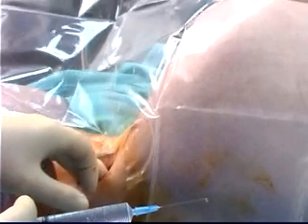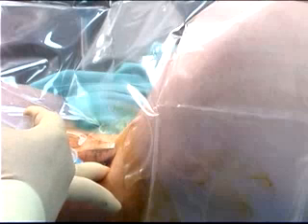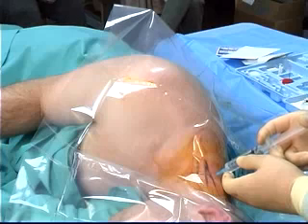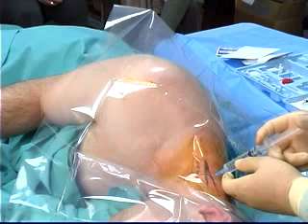After skin preparation, the area is covered with a sterile fenestrated clear plastic drape. The fingers of the non-operative hand separate the muscles, and a 25-gauge needle is used to anesthetize the skin and subcutaneous tissue. This needle remains on the line drawn between the C6 spinous process and the suprasternal notch. The anesthetizing of the subcutaneous tissue is liberal, but only after direct subcutaneous injection.